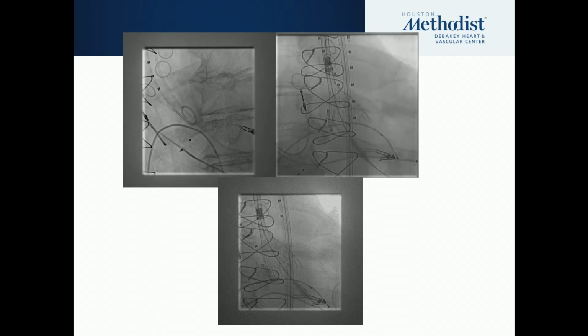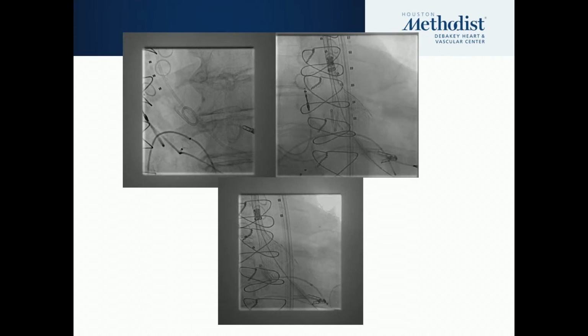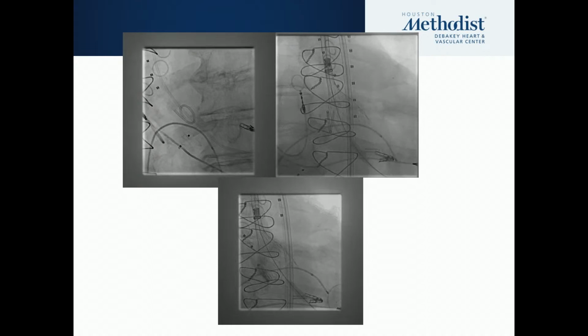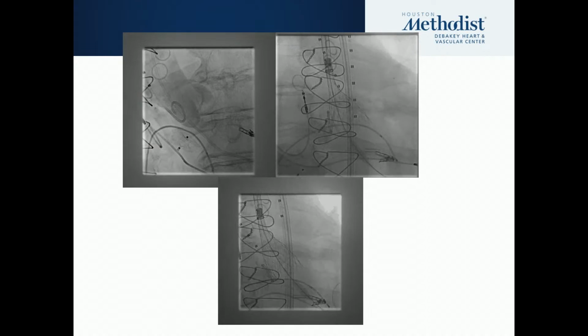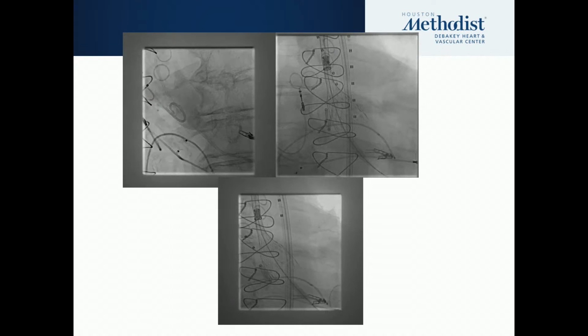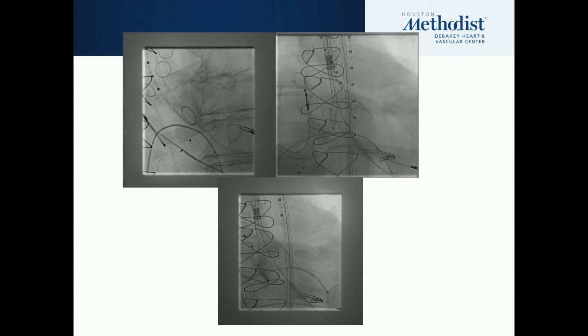This is the TAVR procedure. So this was what we decided to deploy. He was sized for a 29 millimeter Evolut valve, and the deployment is done in the cusp overlap technique, which is our traditional mode of performing self-expanding valve TAVR for the last year or so.